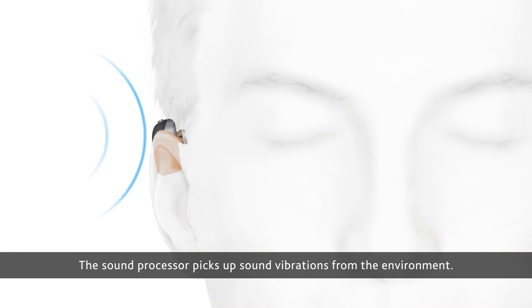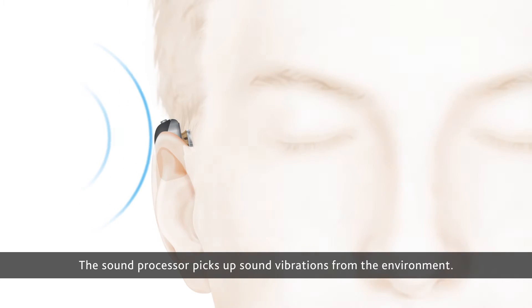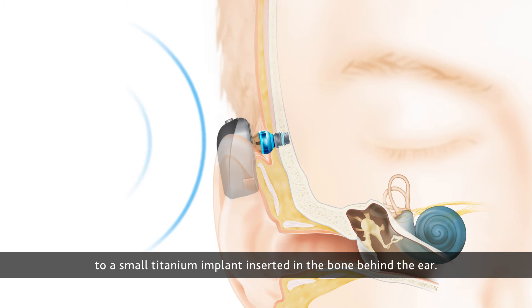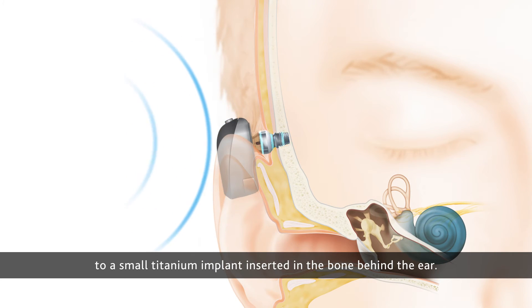The sound processor picks up sound vibrations from the environment. The sound vibrations are transferred through the abutment to a small titanium implant inserted in the bone behind the ear.